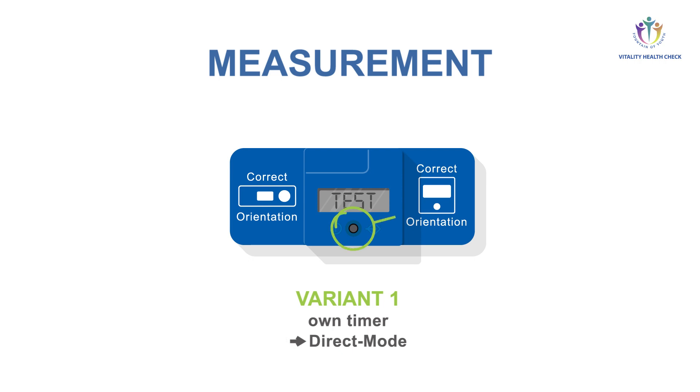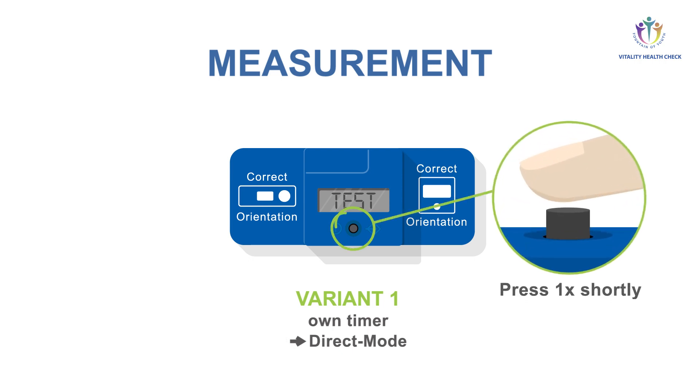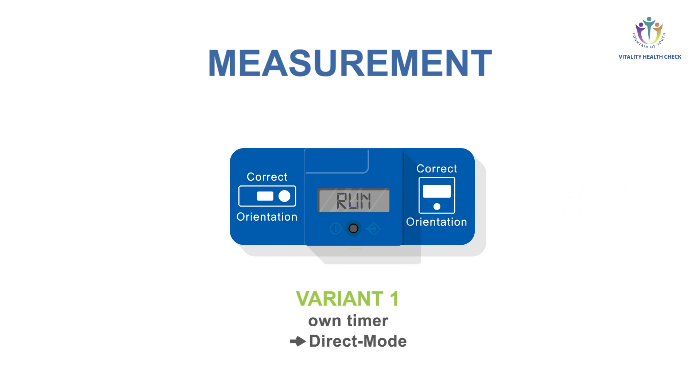The display shows test. Press the button again shortly. Instead of a countdown, the reader shows run and performs the quantification.